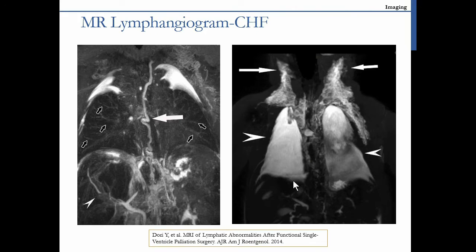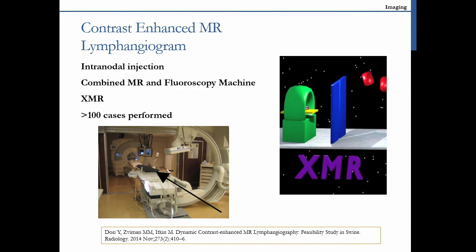However, when do we use that? For example, in a patient with severe right-sided heart failure, this is all lymphatics. This is an extraordinarily dilated thoracic duct, bilateral pleural effusion, and what we often see, enormous masses in the neck and chest and the retroperitoneum because of overflow lymphatic phenomenon. So it's too much flow going into the lymphatics. That's the reason you always see these collaterals. We summarized it and published it one day.